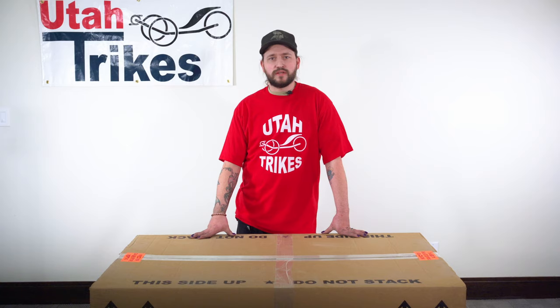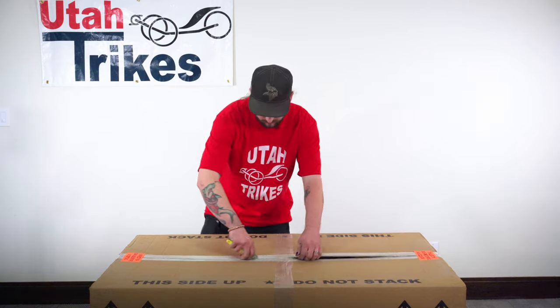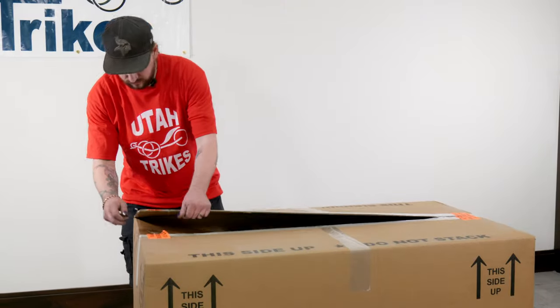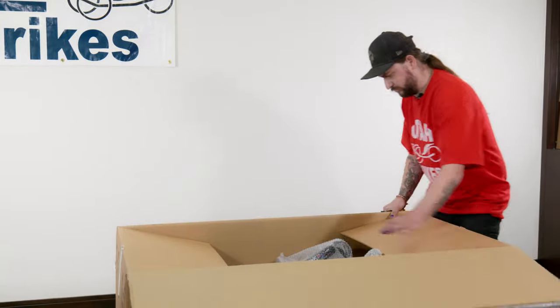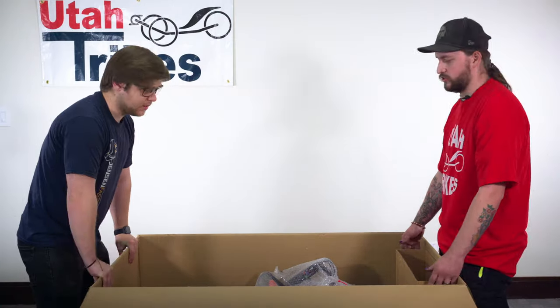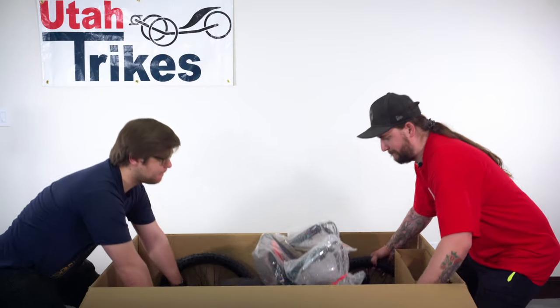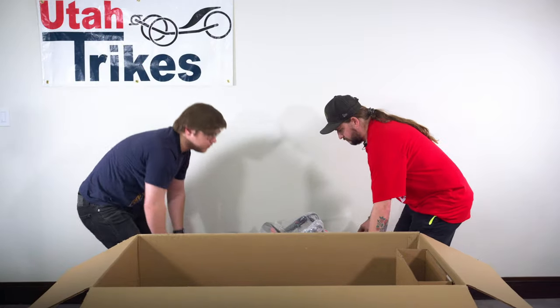When you receive the box, please inspect the packaging for any damages, then open up the box and inspect the contents, making sure nothing has been shifted or damaged in shipping. If there is damage, please let us know so that we can figure out a warranty claim for you so that you can get any damaged pieces repaired or replaced. If everything looks good, go ahead and lift the quad out of the box. It helps to have someone assist you as they can be a little awkward to lift by yourself.